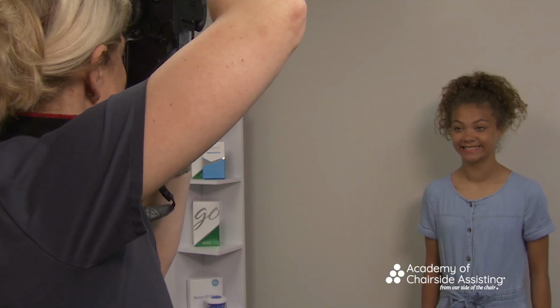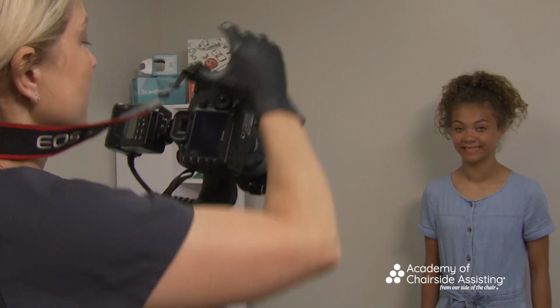I'm going to just quickly take those photos again so they'll be able to see the difference. So now that I've fixed her hair, I want you to see the difference. It's ever so slightly, but it does make a difference. And patients really appreciate the fact that you're telling them, hey, I'm going to fix your hair, or there's something on your face. Better yet, there's something in your nose, right? Be very picky. Take these photos and be proud of them.